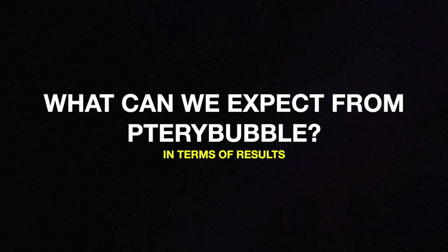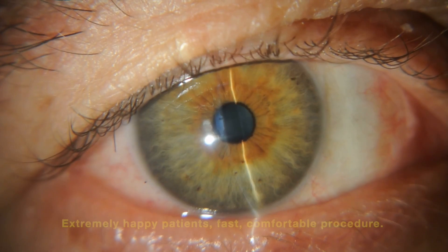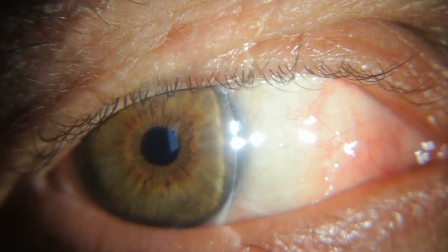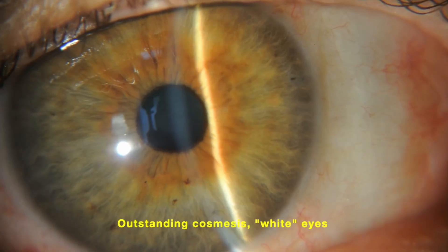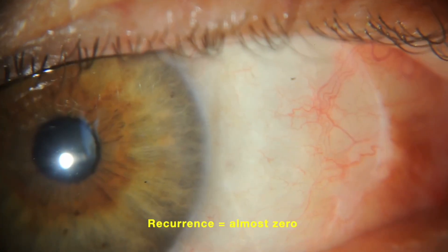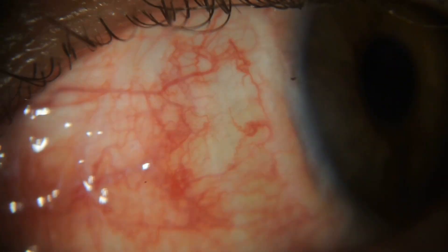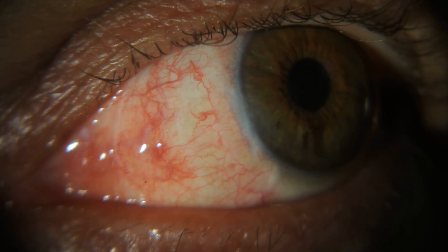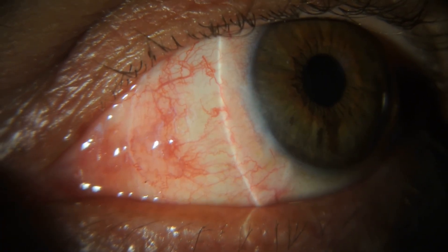So what can we expect from Terribubble in terms of results? Extremely happy patients, as well as a fast and comfortable procedure. Outstanding cosmesis, white eyes, and a recurrence rate that nears zero. At post-op day 15, the fellow or most recently operated eye looks quiet with minimal inflammation. Pterygium treatment has changed — now we have happy doctors and happy, smiling patients.